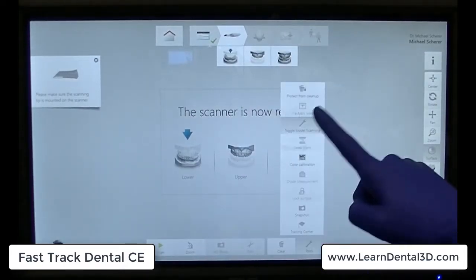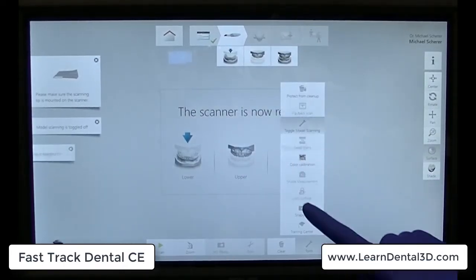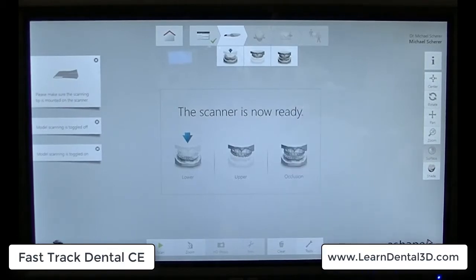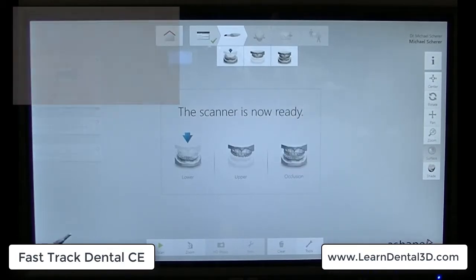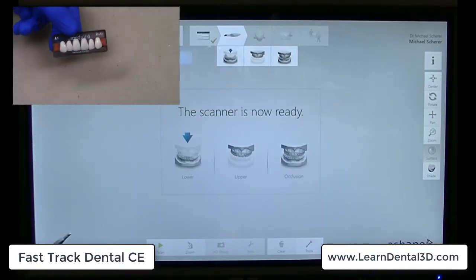I turn on my STL output folder, click on tools, enable model scanning, and now I'm ready to go.